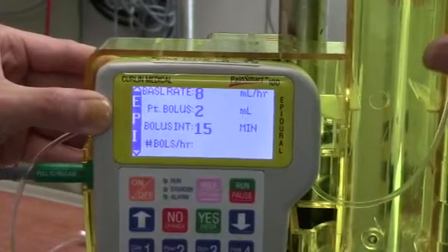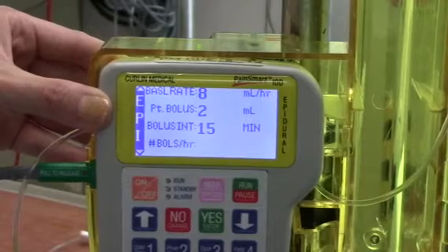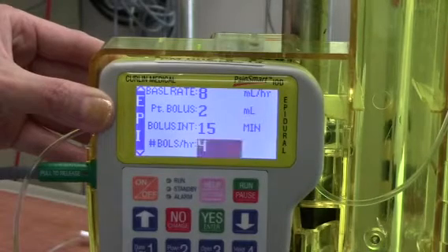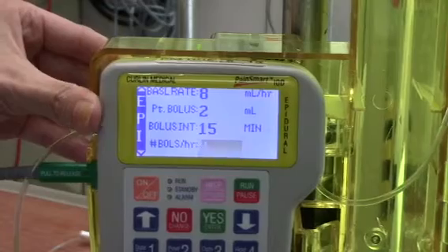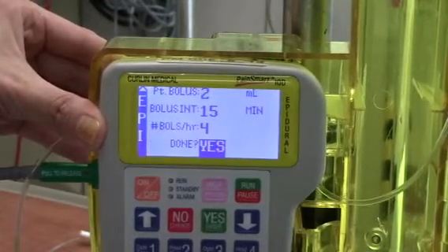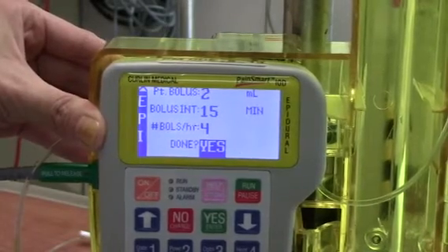It's very important to calculate and make sure that your hourly total matches the doctor's order, and also that the doctor's order is calculated correctly. The program will ask you if we're done, and you will say yes.